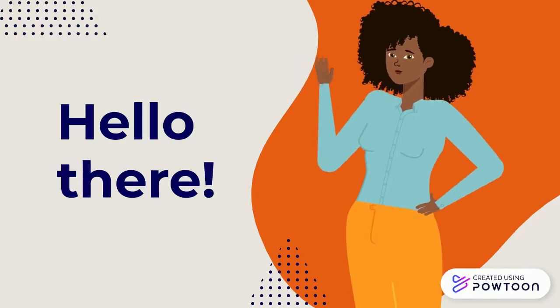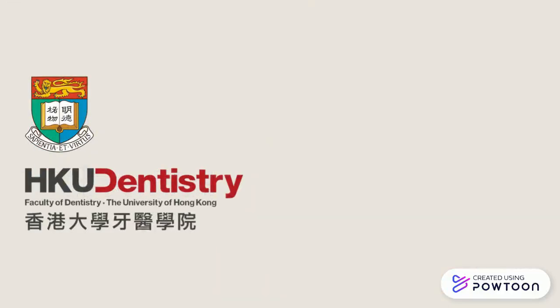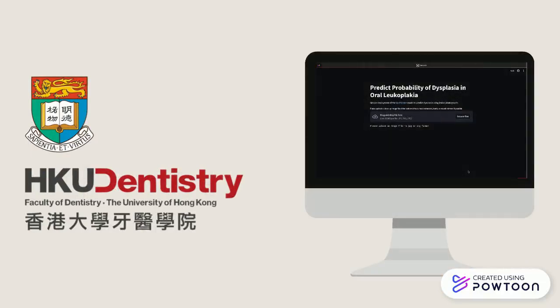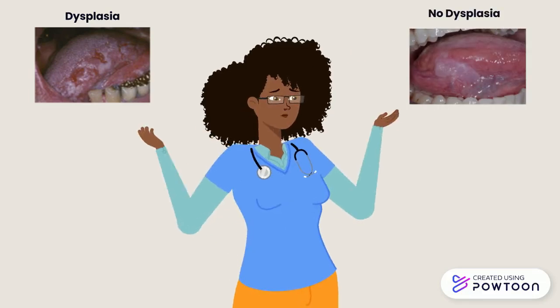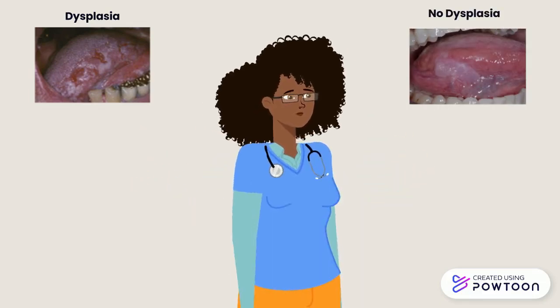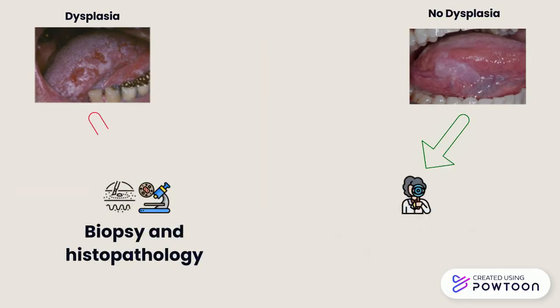Hello there. We at the HKU Faculty of Dentistry would like to share with you an AI web tool that we created to help dentists and specialists decide which oral white lesions are likely to have epithelial dysplasia and should be biopsied and sent for histopathology.